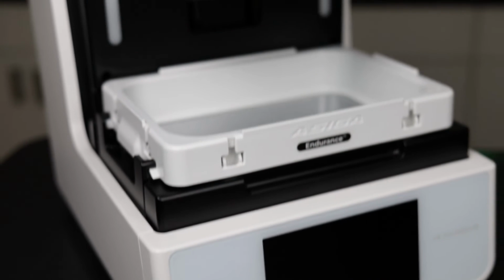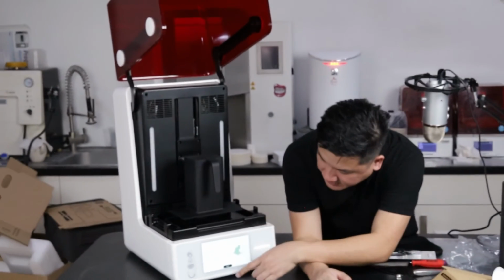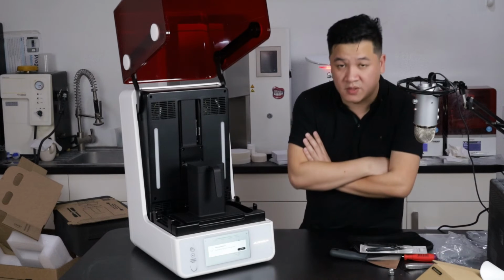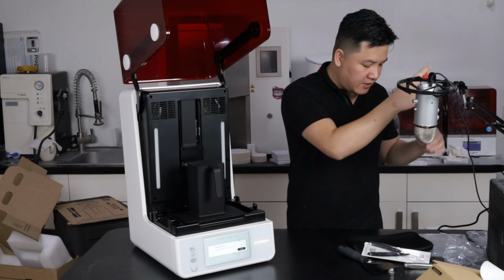Next, okay, we're gonna remove that spacer now. Give you a little warning. All the dialogues, everything, it just feels like we're in a different century now. Continue. Zeroing the platform. Okay, platform will automatically lower to the glass. Let's start. So I mean, Asiga has always had their zero-point calibration. So single point calibration, right? Is what I mean.